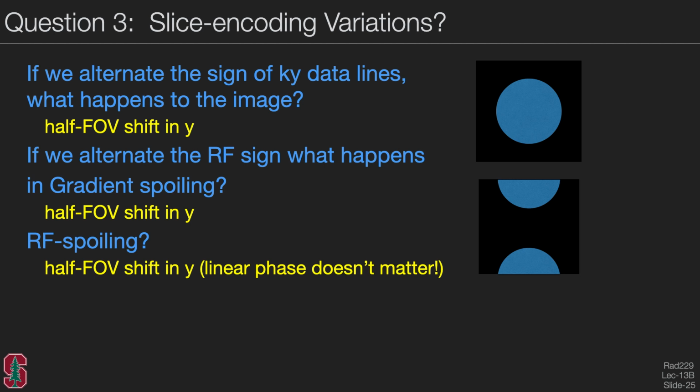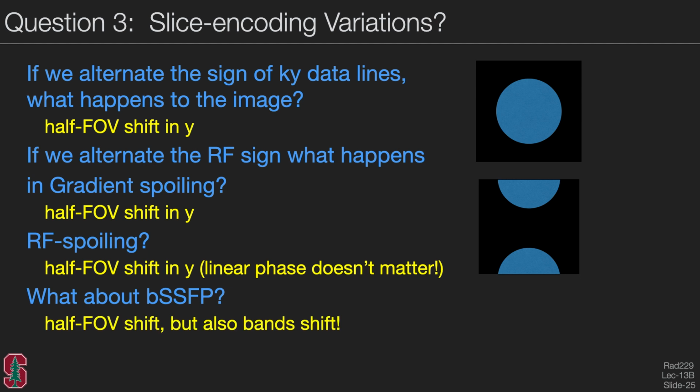And again we have a half field of view shift in Y, because linear phase just doesn't matter in RF spoiled sequences. And what about in balanced SSFP? So here we have a half field of view shift, but we also have this phase cycling approach that we saw before. And this will result in a shifting of the frequency response of the sequence.